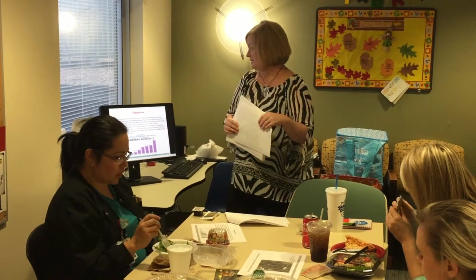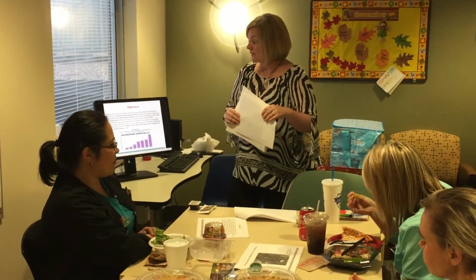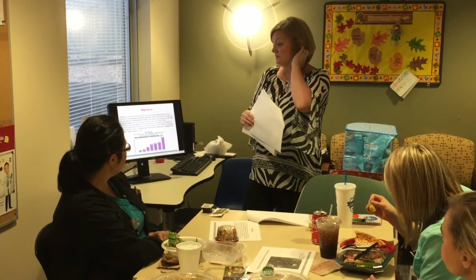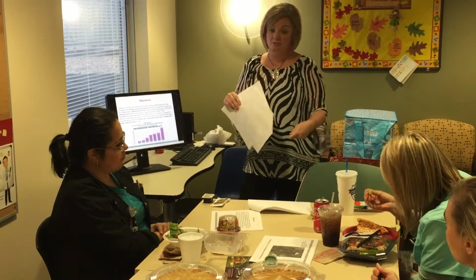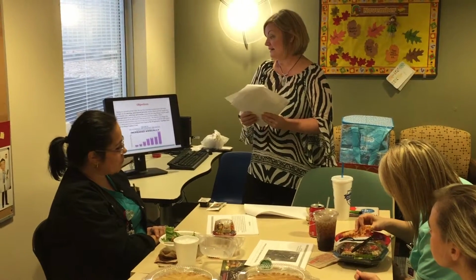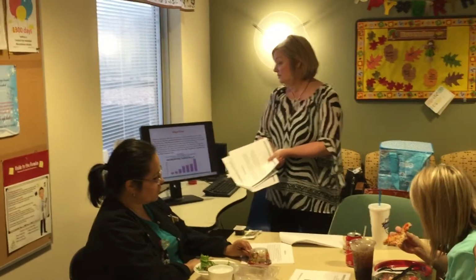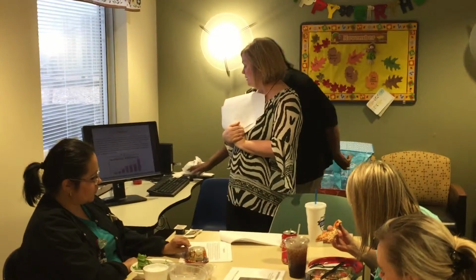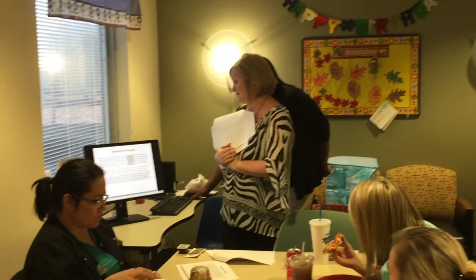And then this group of patients also faces a lot of self-concept issues, not only the patient itself, but also the family. They are required to be attached to some sort of power source at all times. So they do have rechargeable batteries, so if they go out for an activity, they always have to make sure that they have access to a telephone and an extra set of batteries. This group of patients will most likely be treated by the heart failure unit, but since we are sister units, I feel we all should be familiar with this.